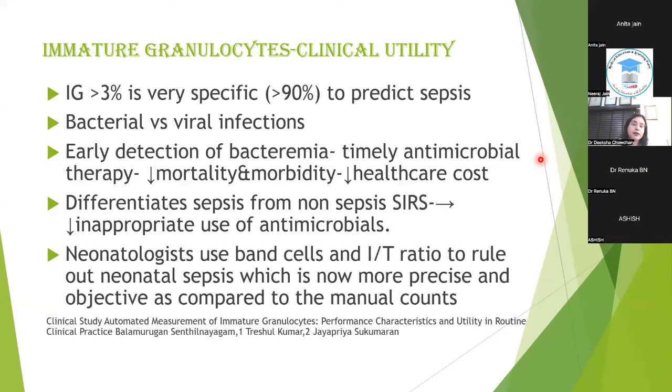Neonatologists use band cells and IT ratio to rule out neonatal sepsis, which is now more precise and objective as compared to the manual counts.